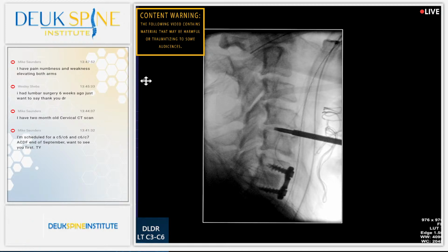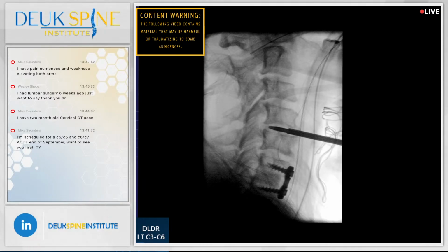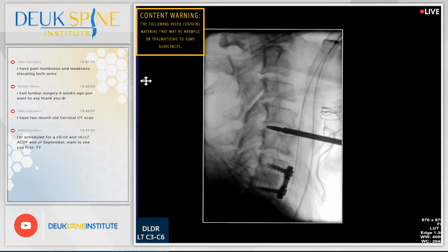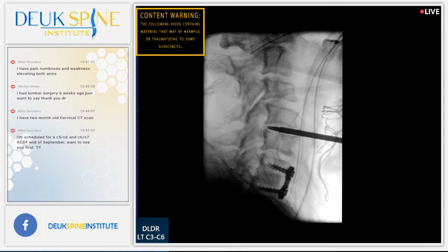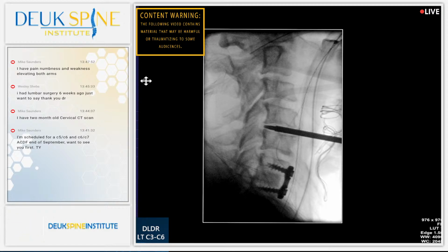Shot. Let's go, Jordan. We need a little more trigger happy finger up there. A little too long on the delay. Let's be generous. Shot. You see the dilator going a little further than I want. I'm going to pull it back. Shot. That's better. Got to control that tip of the dilator.